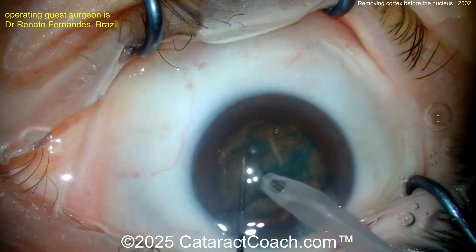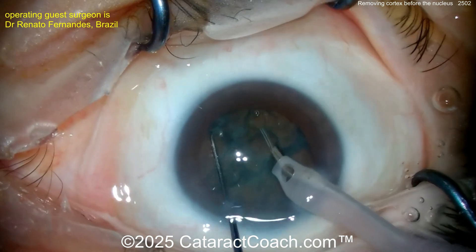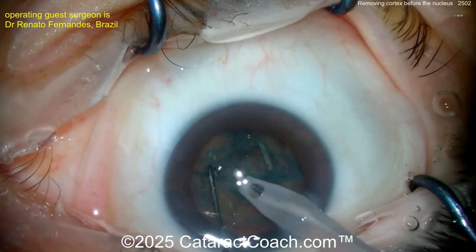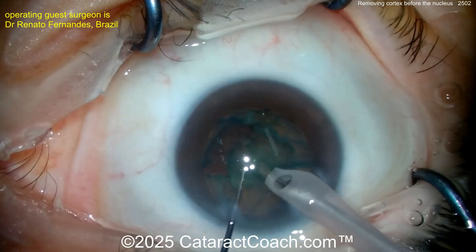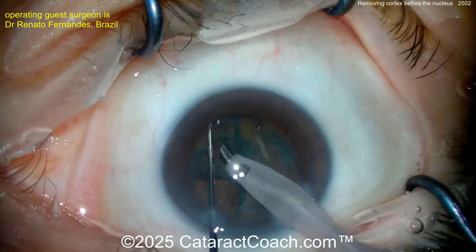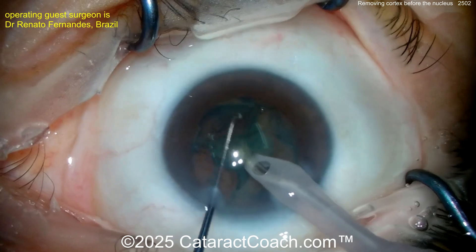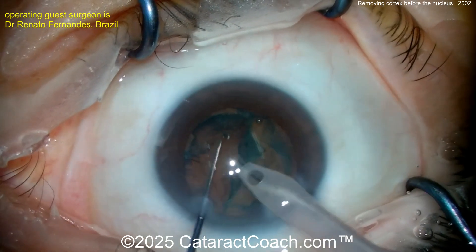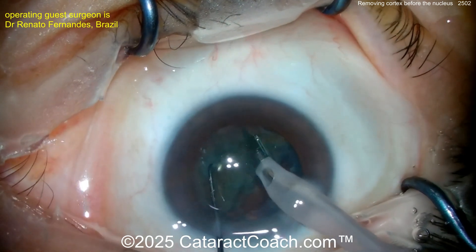Another chop into quadrants — very adept technique. I want to see what's going to be left in the bag when moving the nucleus. Bringing that one quadrant up — once you get that first piece up the others come out a lot easier. There you go, bring that second quadrant up. Not a very dense nucleus, but hey, I'm from Beverly Hills — I'm used to these.